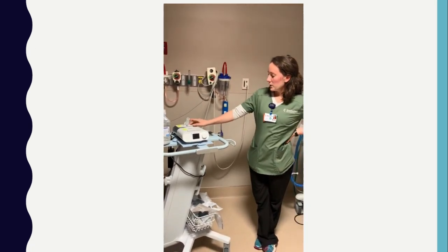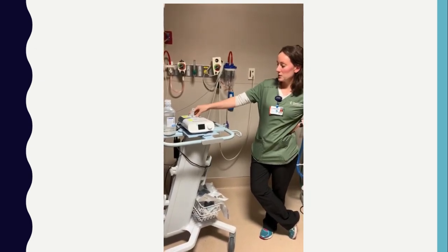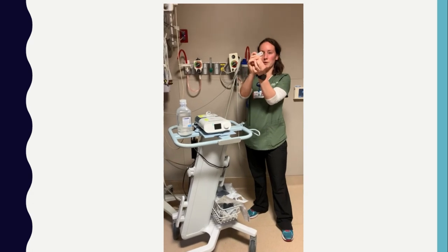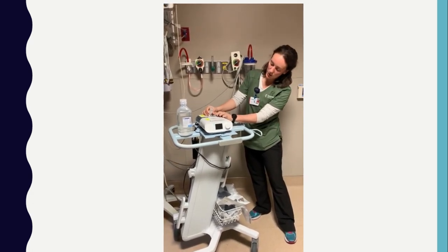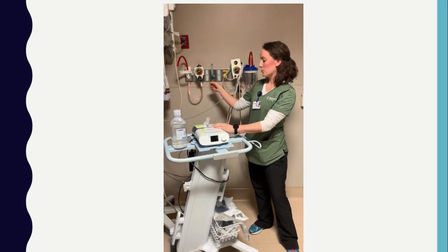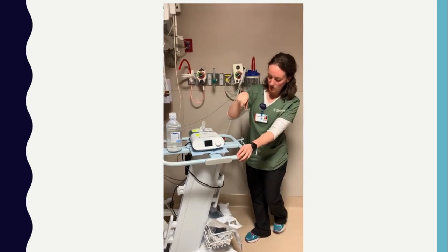Another thing to remember, a lot of times you will have physicians that will want to order O2 bleed-ins on our CPAP machines. And that's what this little piece right here is for. This is a little adapter, we like to call it. It attaches right here and it has this little part that sticks up. Whenever you have an O2 bleed-in, you're going to attach the O2 tubing to this little piece right here. And then you're going to attach the other end to the flow meter. And that's where you'll dial in your O2. The circuit will go right here, and then the other side will go to the patient.